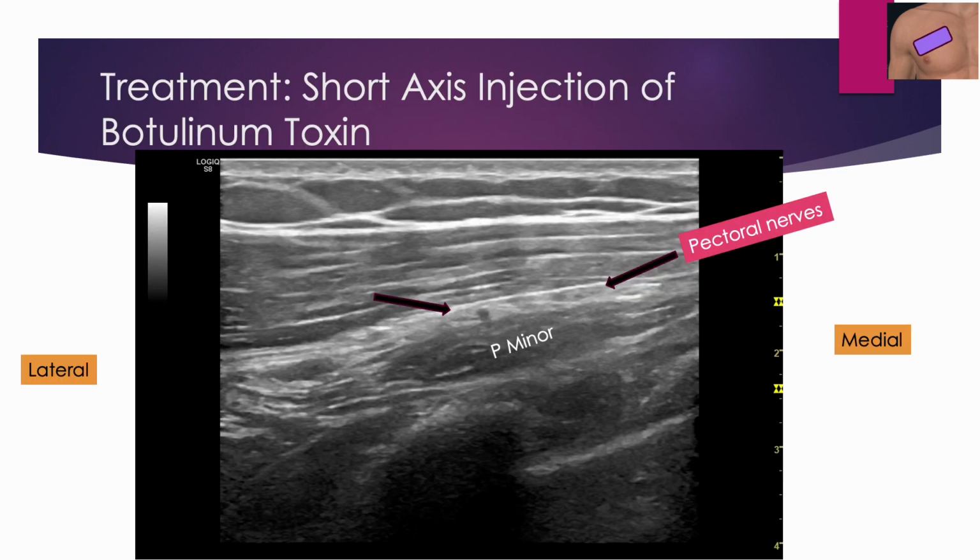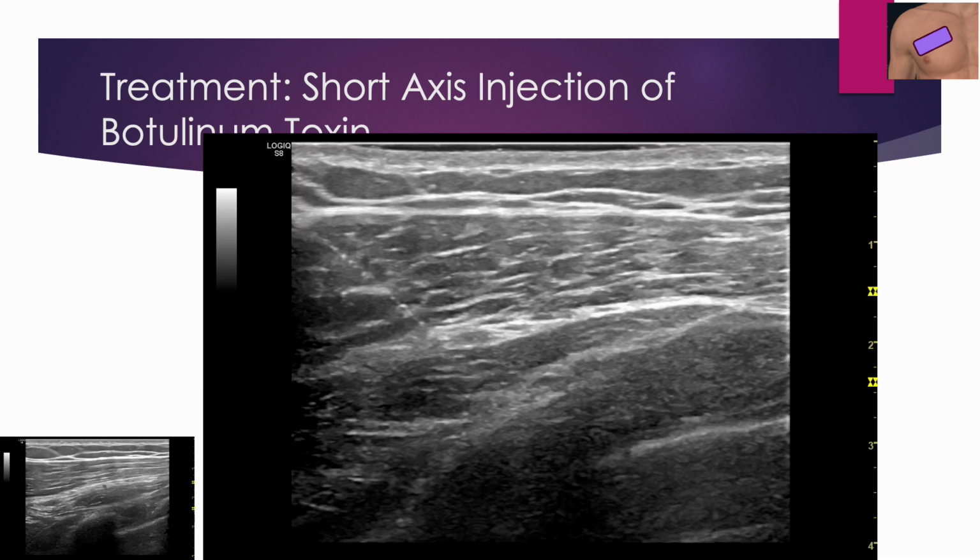This is a cross-sectional view with the left side being lateral, showing an area of hypoechoic muscle that would be targeted by the needle. Between the pec major and minor, neurovascular bundle can be seen. Again, in cross-sectional view, the needle can be seen from the left side of the screen into the pec minor muscle, passing just lateral to the neurovascular bundle.